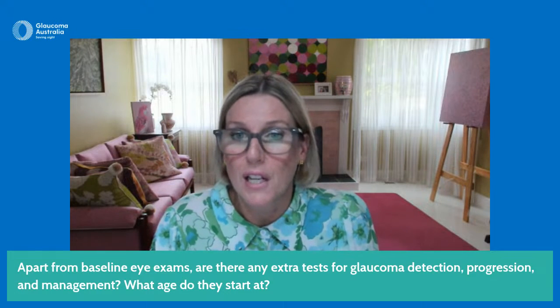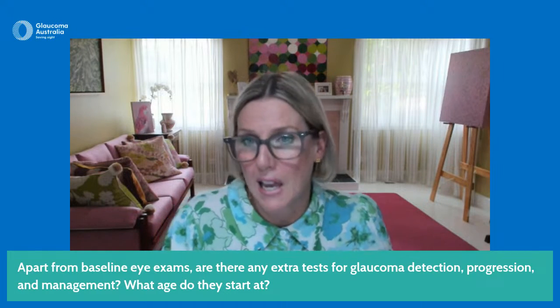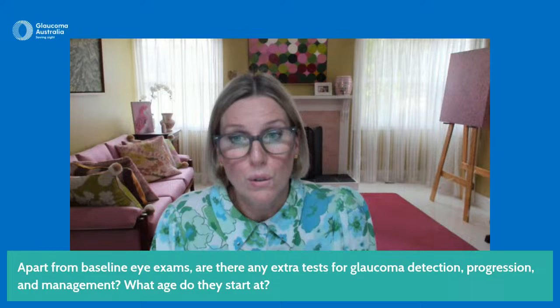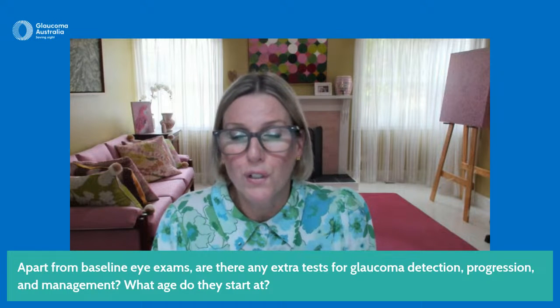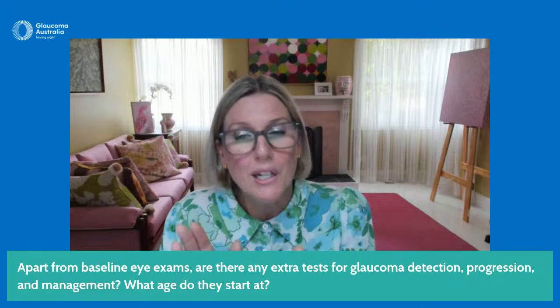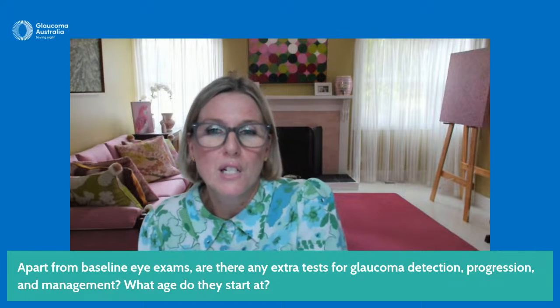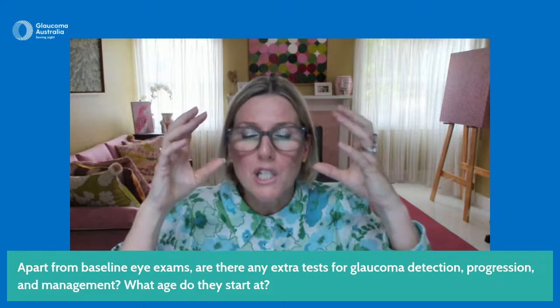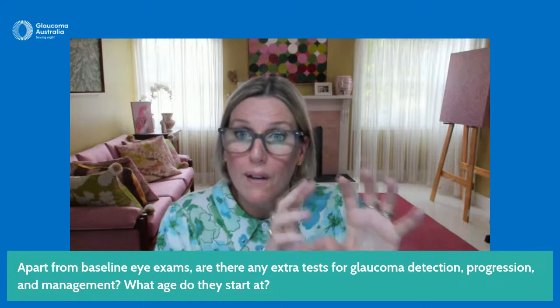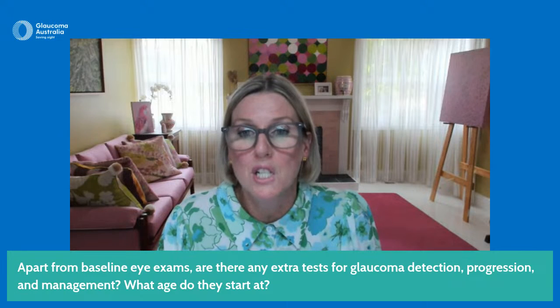Yes, intraocular pressure definitely is one that we like to do and can do from a very young age. Then we have the additional tests such as the retinal photographs, the fundus photography. Sometimes we're lucky and we can get that done from the age of 2 or younger, but often it's around the age of 3 or 4 we can start taking those photos, and they document what the inside of the eye is looking like, so it makes an easy reference point when we have that photography to refer to each time.